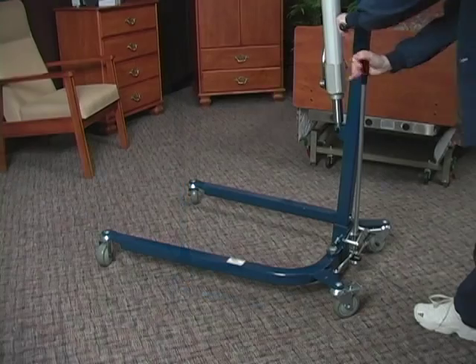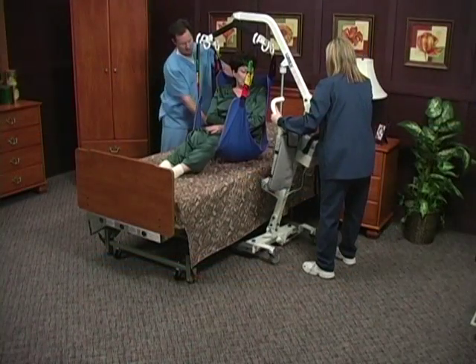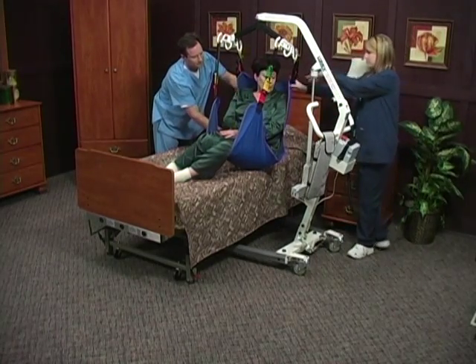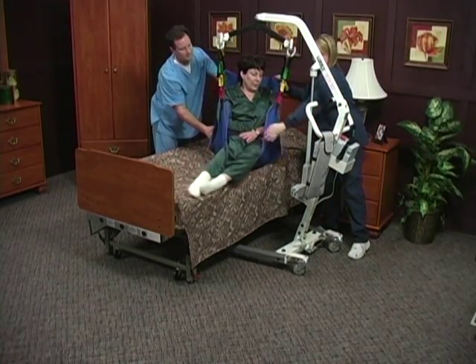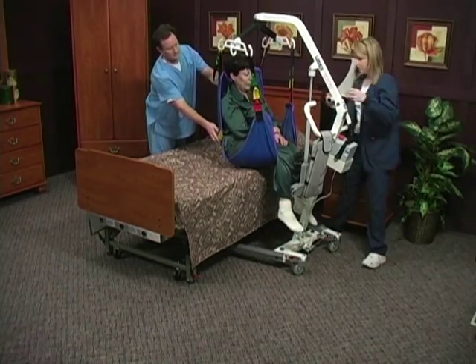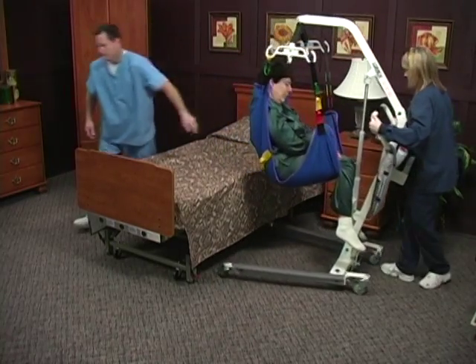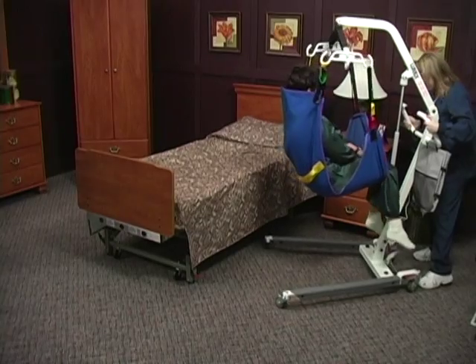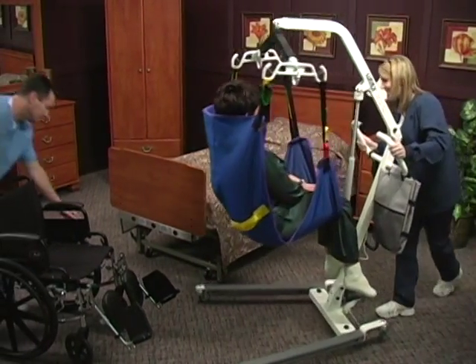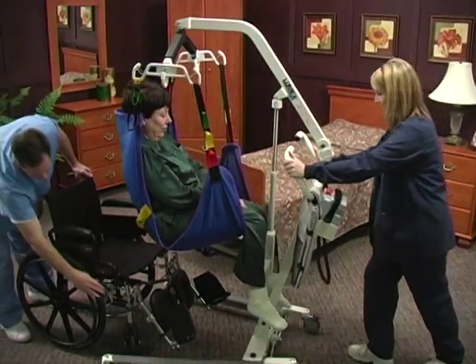The device to spread the legs on the LF-1030 base is somewhat different and utilizes a simple hand lever. The casters on the rear are locking casters. During a lift, you should unlock the casters and spread the lift legs. This allows the lift to self-adjust as the resident centers over the lift and provides greater stability. The legs of the LF-1050 and LF-1090 can be in the open or closed position during transport. Never pull or push the boom; positioning should be done with the push bar and grab handles.